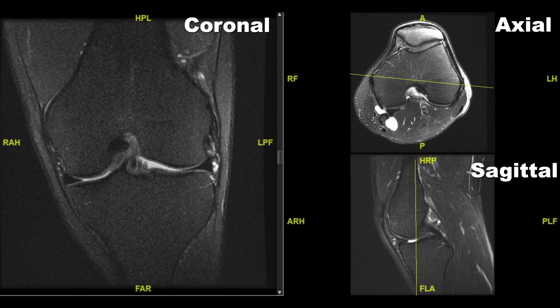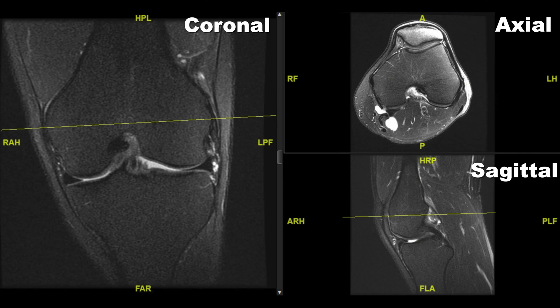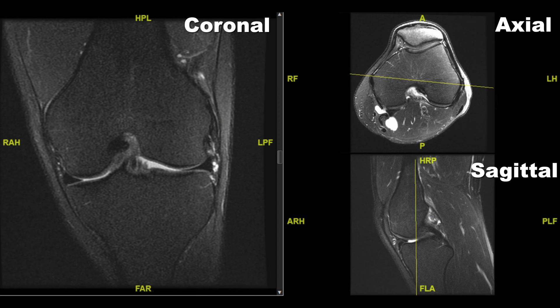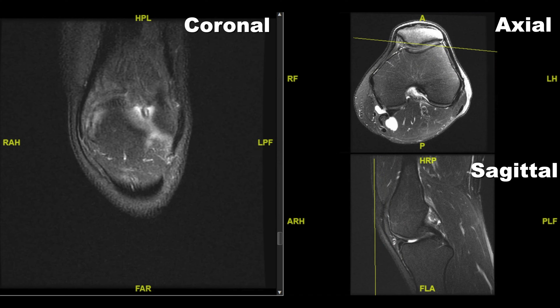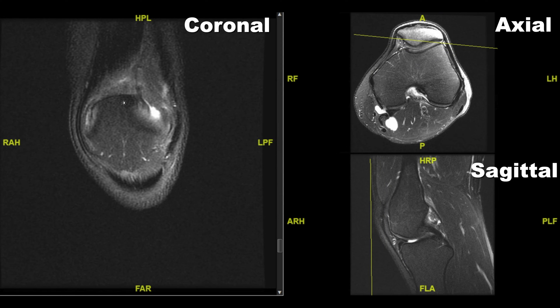Let's look at the axial. This is the front of the knee, or anterior; this is the back, or posterior; this is the outer side called lateral; and this is the inner side called medial. Let's start all the way at the front of the knee. On the coronal we can just see our kneecap, our patella, and the localizer line is showing us where this coronal image is in relation to the axial image.